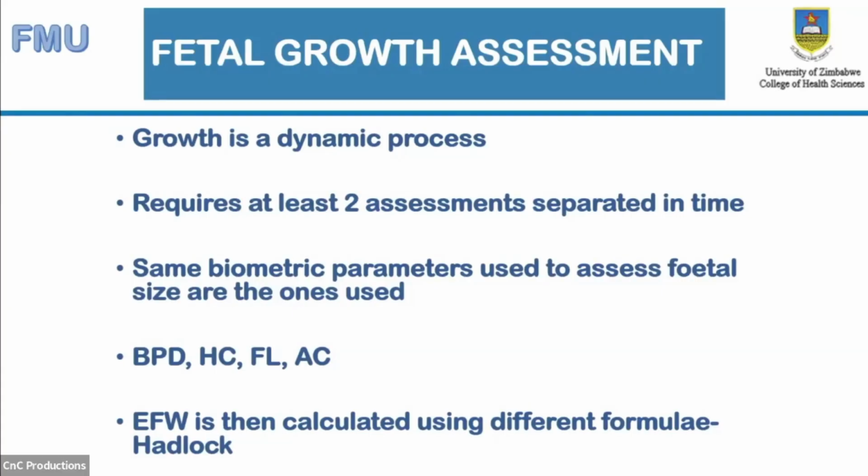So it's good to standardize at a personal level, but it's also good to standardize at a national level. And this is why the different parameters have to be measured at specific points, which I'll be touching on in the next slide.